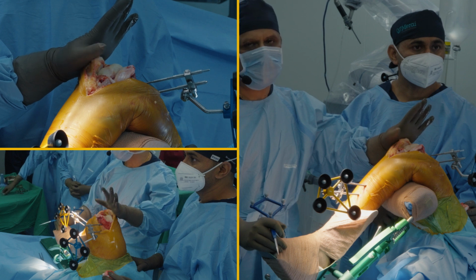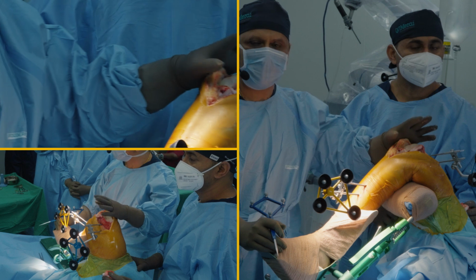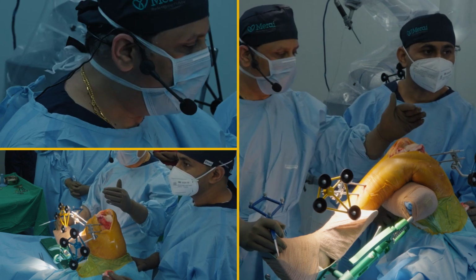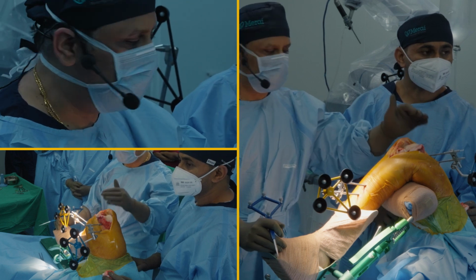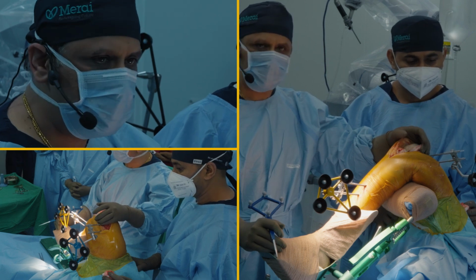So it is just a static pre-plan what I have done. I can go inside always, I can change the points, and I can change my plan. So the plan is not rigid. The plan is only to come inside the theater to upload the pen drive onto the system. So let me start marking now.